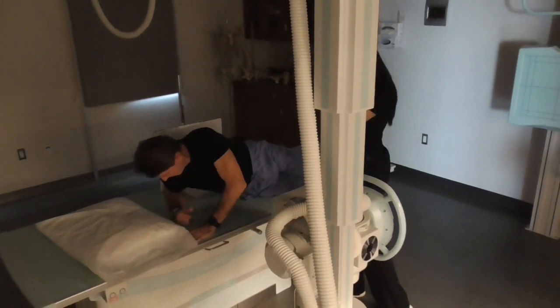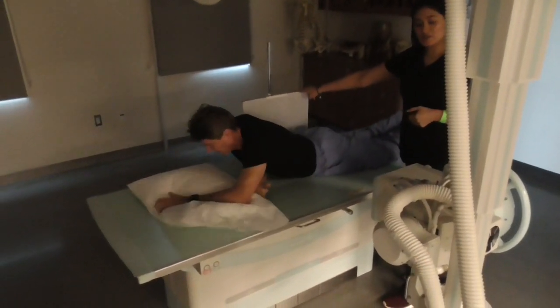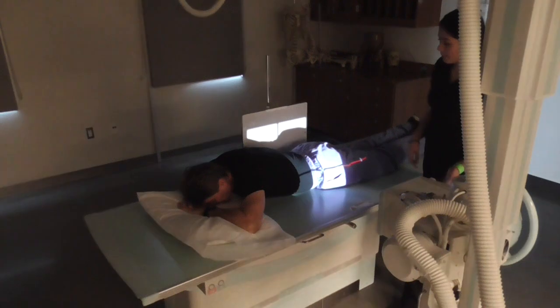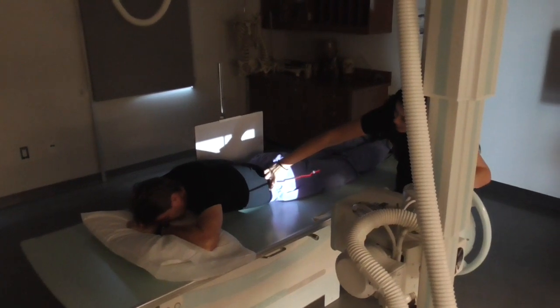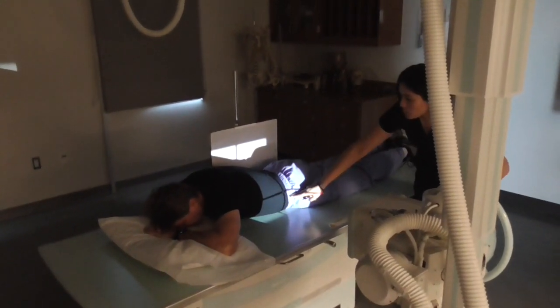We will be using a 14 by 17, we will still be centering at the level of the iliac crest, and at the mid-coronal plane.